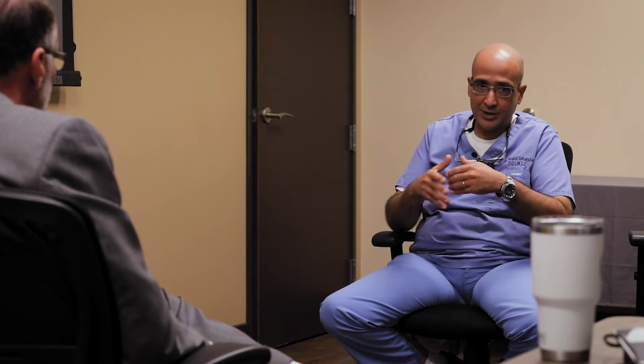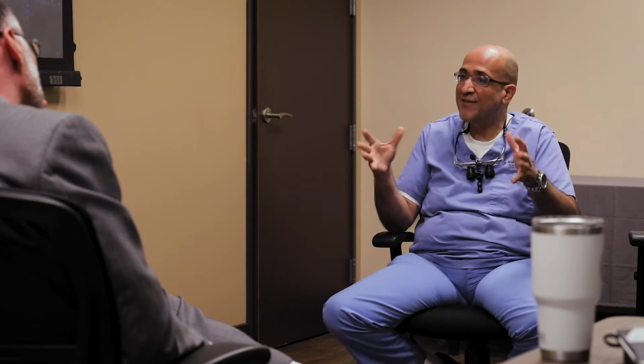And I always tell the patient, even before the surgery, when I see the condition of the jaw, maybe you are not one of those, but sometimes it happens. Bone is not that great. We need to put the implant and graft, and the implants are not in a very sturdy or strong position to have an immediate loading, which is this bridge that we install the second day.